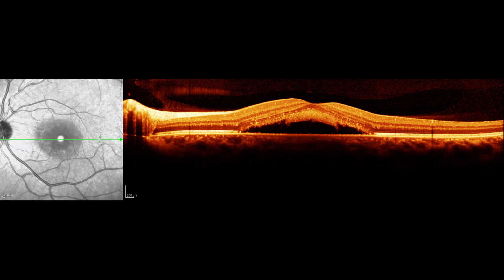I get the autofluorescence and the FA and the ICG, but most likely it would be fairly fresh subretinal fluid from some cause. So CNVs don't usually look like this. This is a pretty typical configuration for CSR. I think I've seen a choroidal hemangioma that's looked a little bit like this. But yeah, if you don't see drusen, it's really hard to call it AMD.